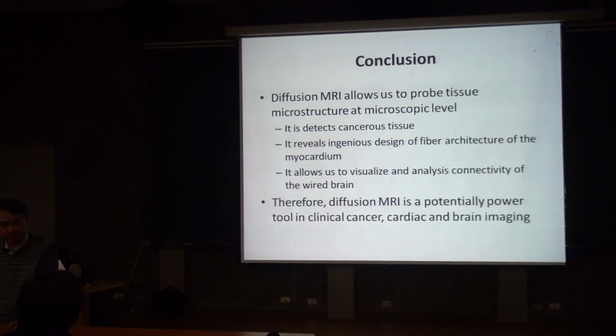And what's the limit? Yeah, there's a limit. If I had some magic power, of course I would want 1 millimeter cube. That's perfect, right? But I cannot do that, because once you have smaller and smaller voxel size, that means smaller image elements, you have less and less signal.